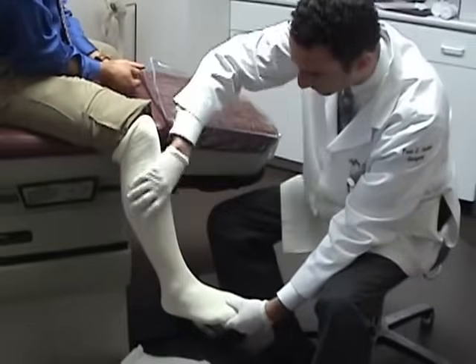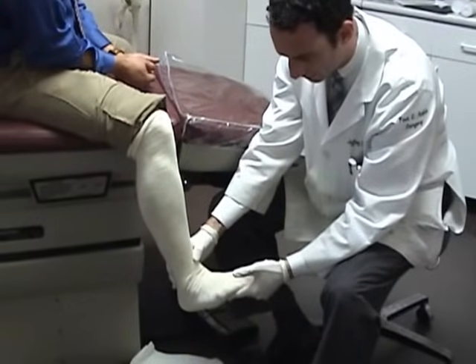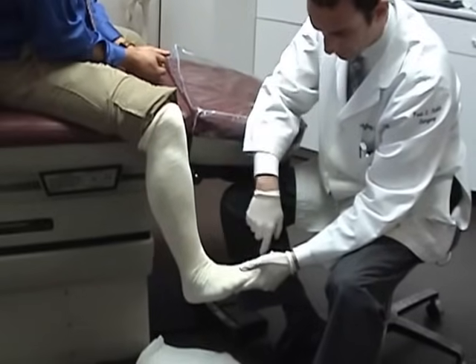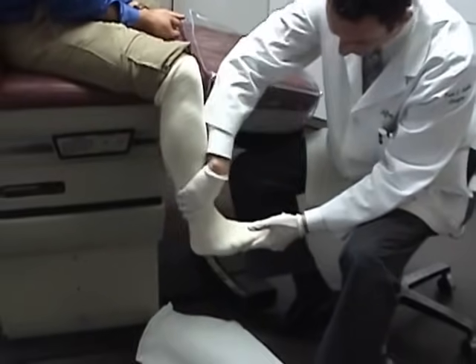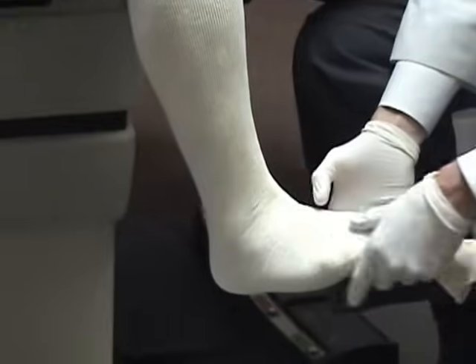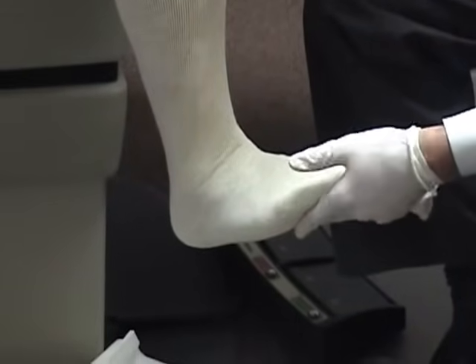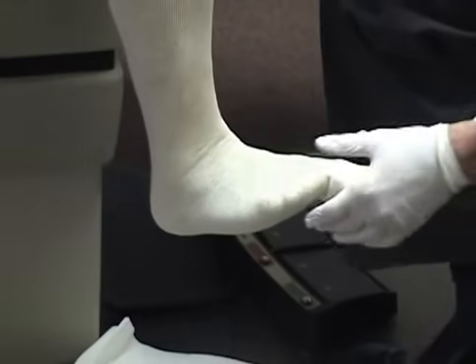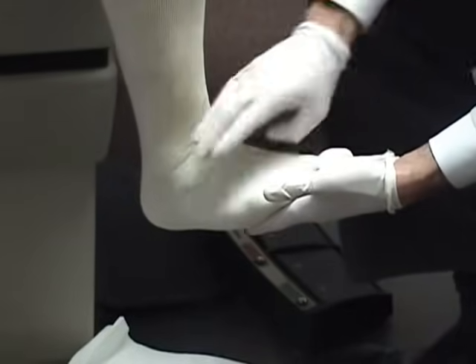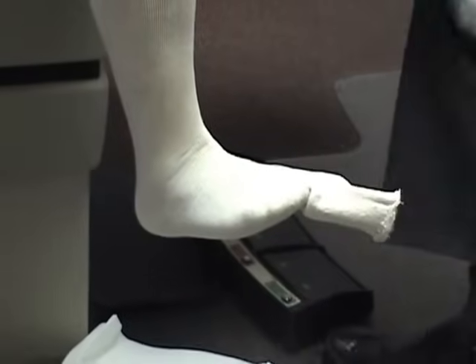No wrinkles. Throughout the entire process it's going to be important that the foot is at 90 degrees on the leg. We're going to get those wrinkles out and ask our patient to hold the foot at 90 degrees as best he can throughout the entire thing. If the patient gets fatigued, you can always help by supporting the foot at 90. So that's our first step.